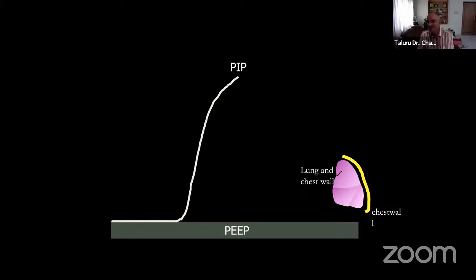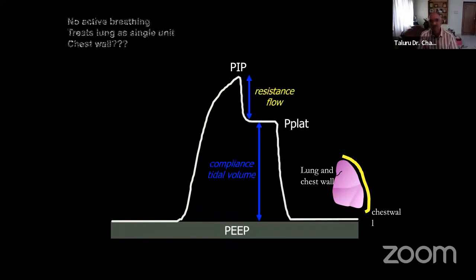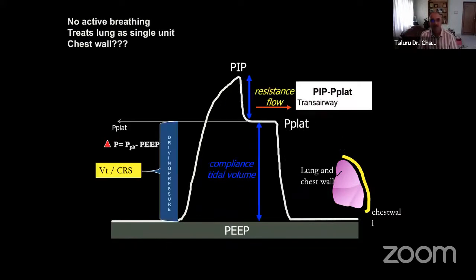Now that you make a decision, it's a chest wall, you can expand the borders of the lung protective ventilation. I think I'll just skip this. I've told you many, many times, to an extent where people may be getting upset that I'm stressing on the same 5 things. But this is all you have to understand in mechanical ventilation. If you understand this one slide and you work around it, all patients from your OT and ICU go home properly. You take my word.